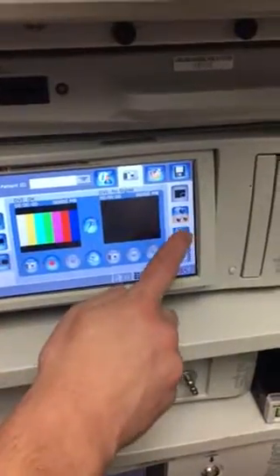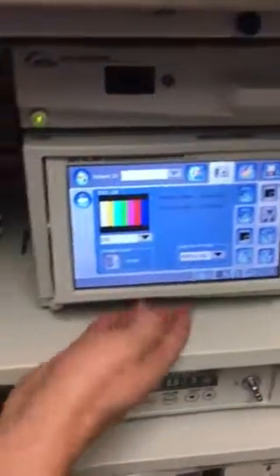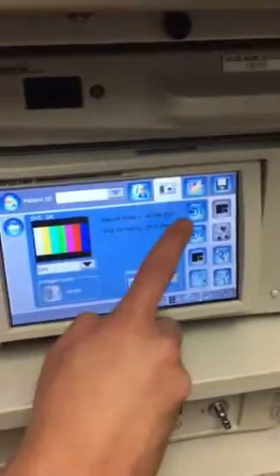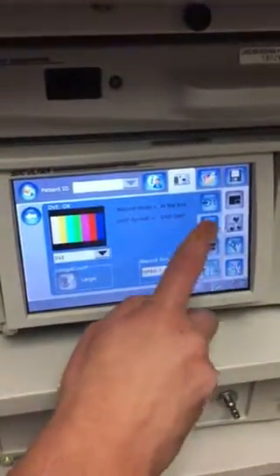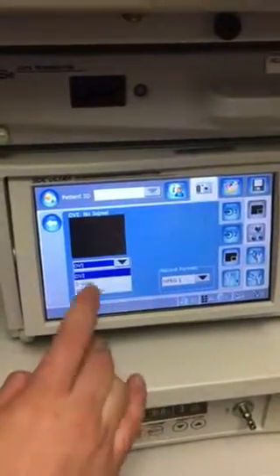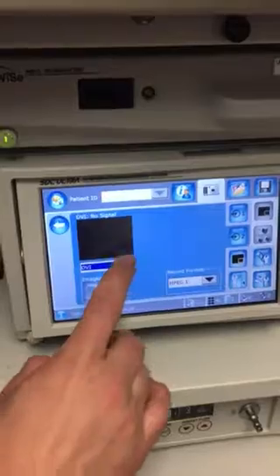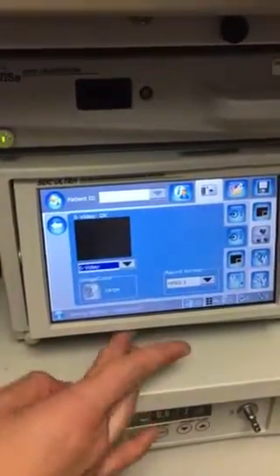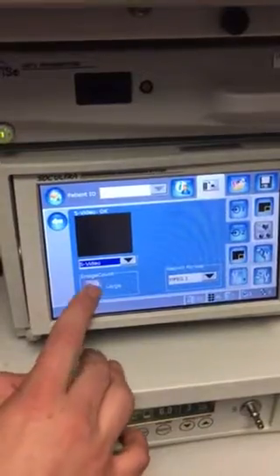Then go to settings — the picture settings, not the printer settings. Make sure that's on DVI, which is number one, then click on number two. From the drop-down, you want that on S-video, and then make sure that's set to large as well.